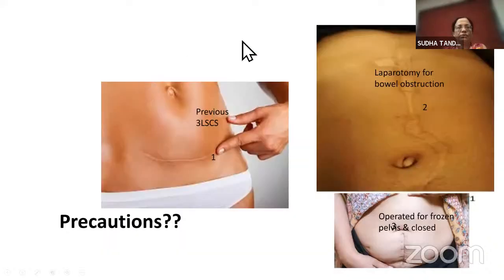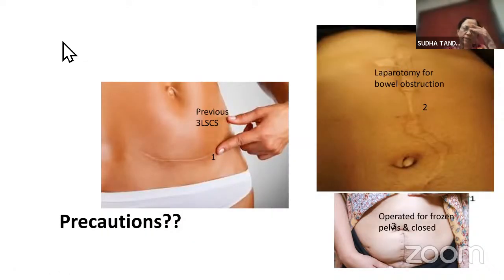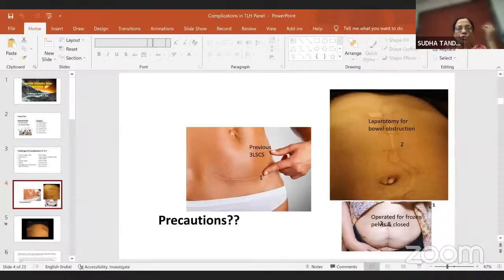Yeah, I think if she's for hysterectomy, right? Because we have set all our complications to hysterectomy. Most important is the complication which is entry related, and 50% of the complications of laparoscopy are entry related. So I think it's important that each laparoscopic surgeon is familiar with at least 2 to 3 ways of entering into the peritoneum. Of course we have to use a safe method in this patient.